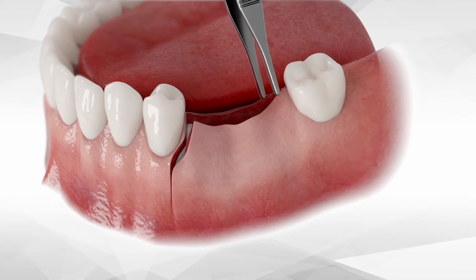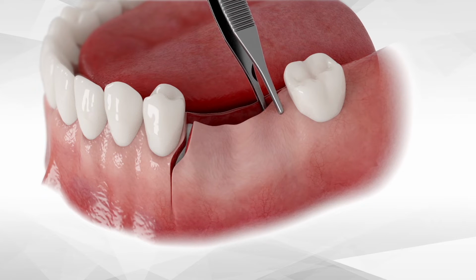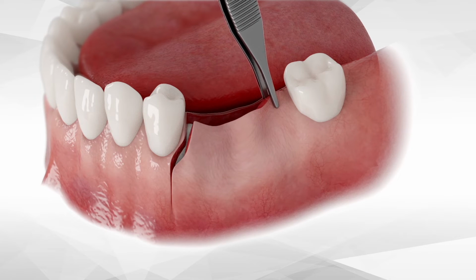Stretching of the flap is something that is not taught with traditional grafting techniques. However, with bond apatite, no periosteal releasing incisions are recommended. Instead, the flap covering the graft has to be under tension.